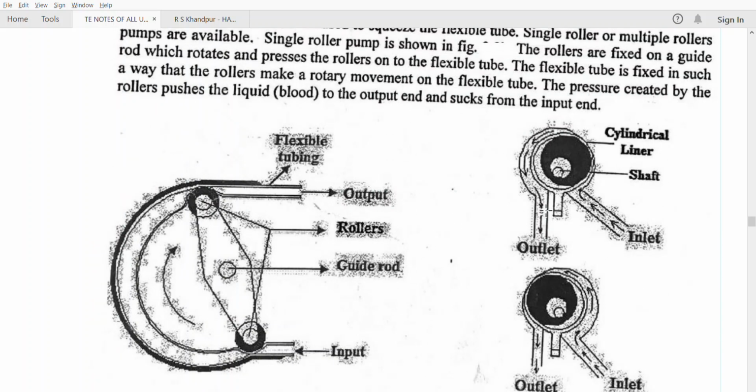So you have seen about the different pumps, you have seen about different oxygenators. What is the need of pumps? Pumps are for doing the function of the heart. What is the need of oxygenators? They are doing the functions of the lungs.